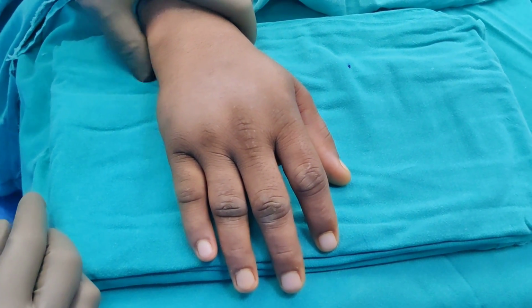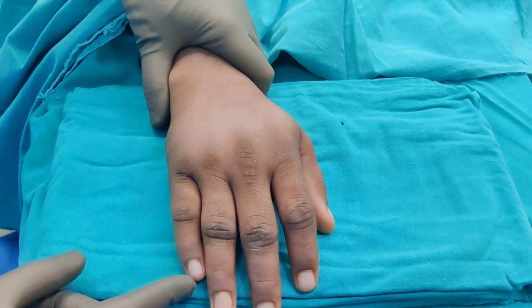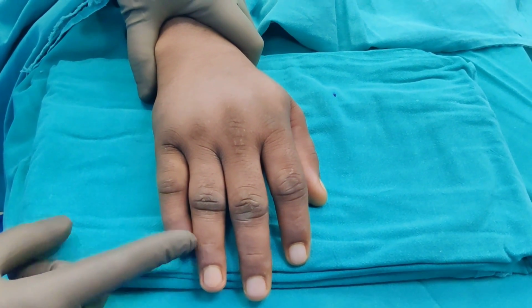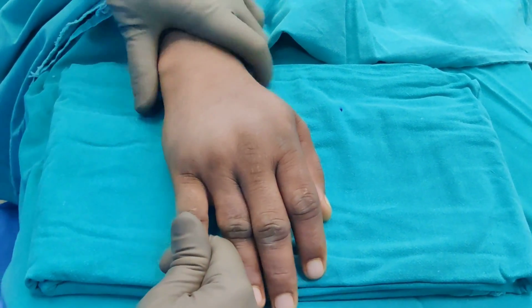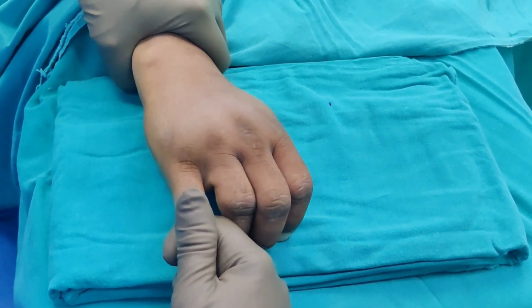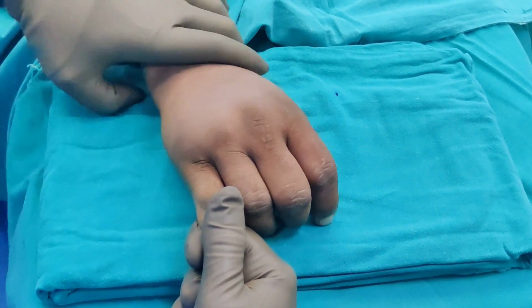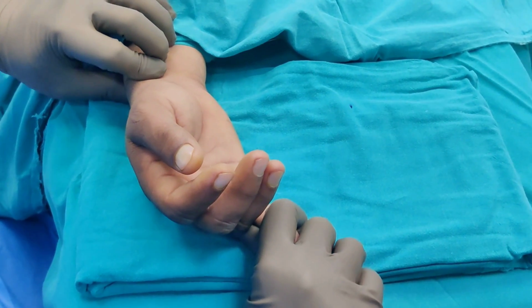Now, if you want to reduce the fracture into an acceptable position, you don't need to do anything. If you see this, the little finger in comparison to the ring finger, this finger is just at the level of the DIP crease. On the other hand, it is slightly distal. So all you need is just gentle traction. Once you give a gentle traction, it usually brings the fracture into an acceptable position, and then we'll take some X-rays. So while in traction, we have taken view one like this and one like this, and I'll show you how it looks.